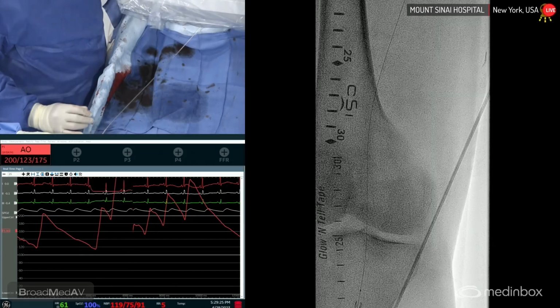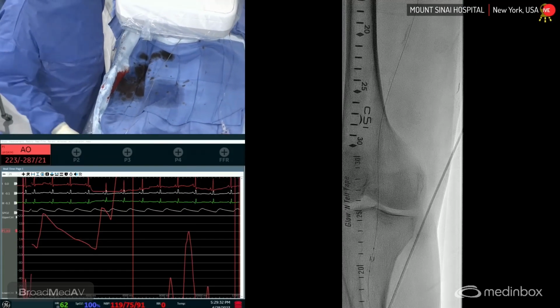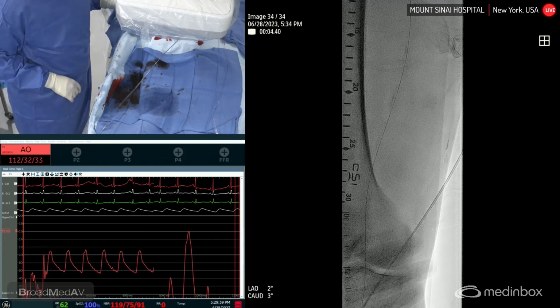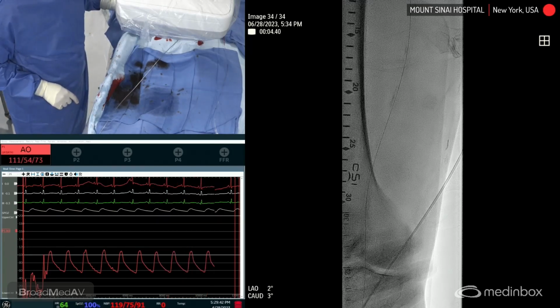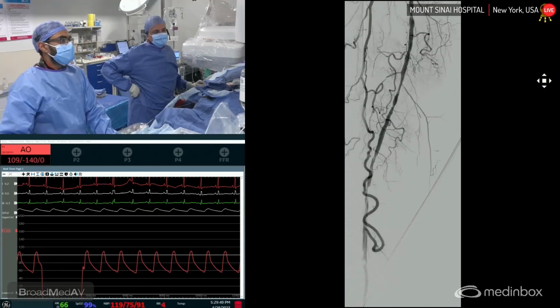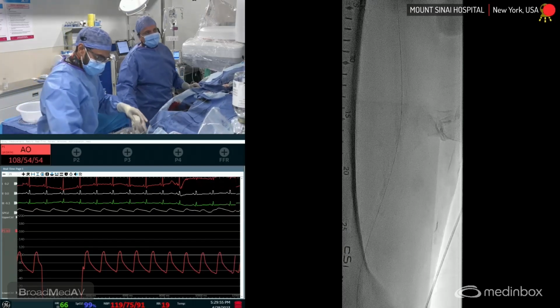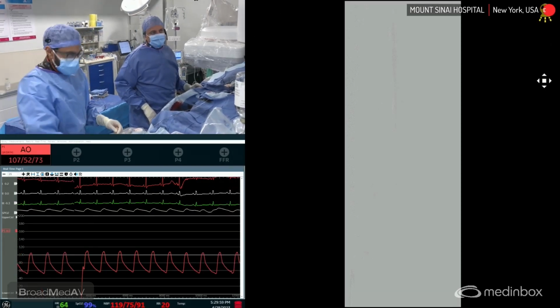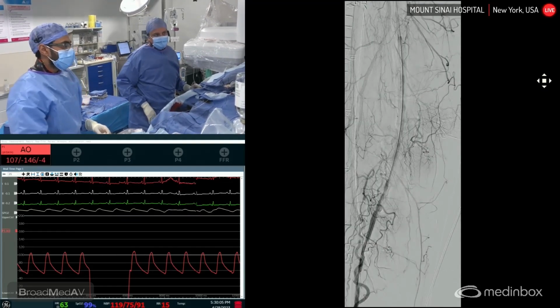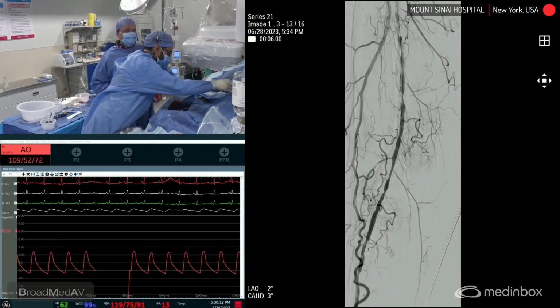So now that we've done an aspiration thrombectomy, we're going to go ahead and do a DSA. A little more. Yep, you're out. Off. Okay, ready for DSA? Inject. So now we're going to inject and see what the flow looks like. And look at that, guys. See, the flow is better now through the SFA and not through the profunda, without a single balloon. And you can see here, we've actually been able to clean out the majority of the underlying. See, look at that. So even though the SFA has significant lesions, you've been able to aspirate out all the clot and all the debris that was slowing it down, and you can see the before and after picture.